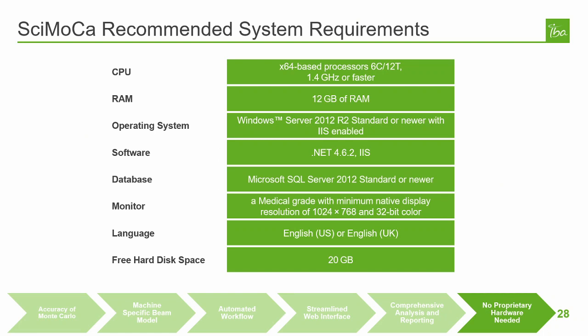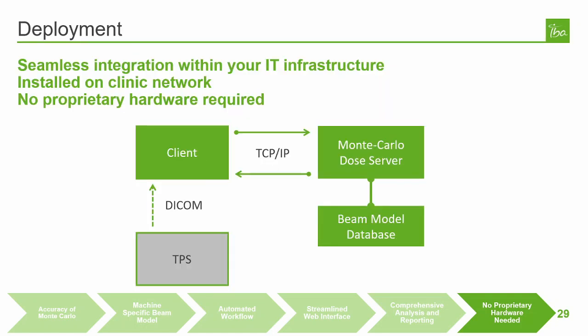The server requirements for SciMoCa do not include any proprietary hardware, physics cards, or graphics cards because the calculations are performed by the CPU. This means that a server can be easily provisioned from an existing virtual server infrastructure or discrete hardware. The client-server model of SciMoCa integrates directly into your existing IT infrastructure, and the service-oriented architecture means that all of the calculation queuing and data processing is done in the background.